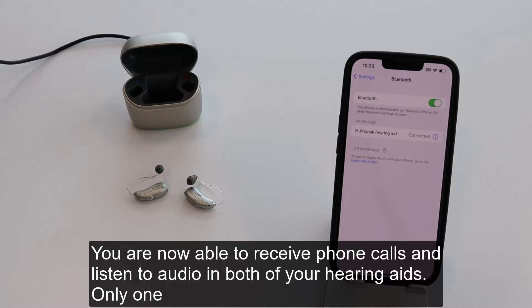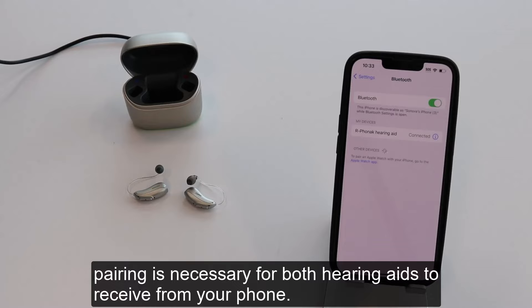You are now able to receive phone calls and listen to audio in both of your hearing aids. Only one pairing is necessary for both hearing aids to receive audio from your phone.